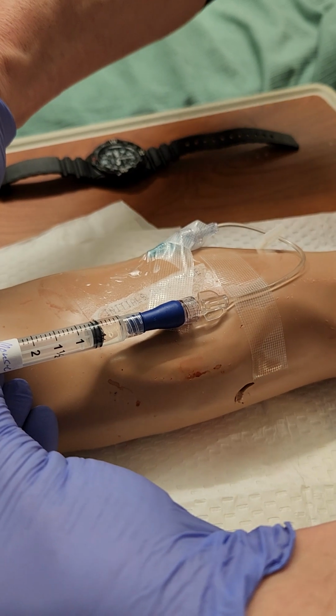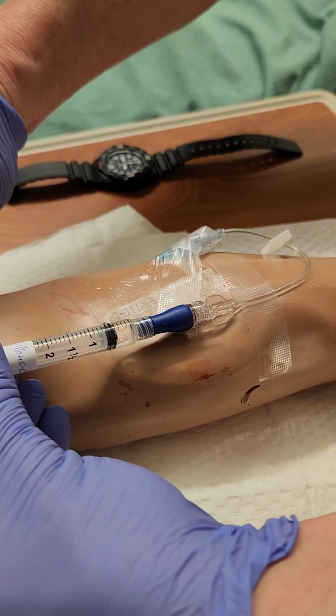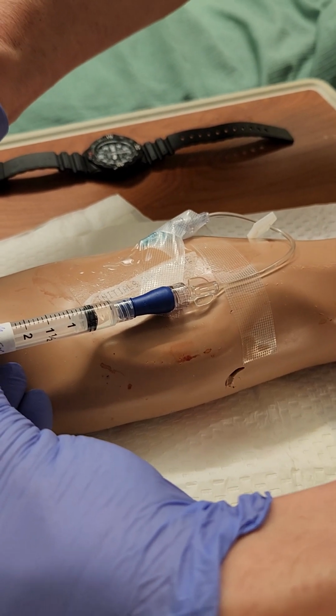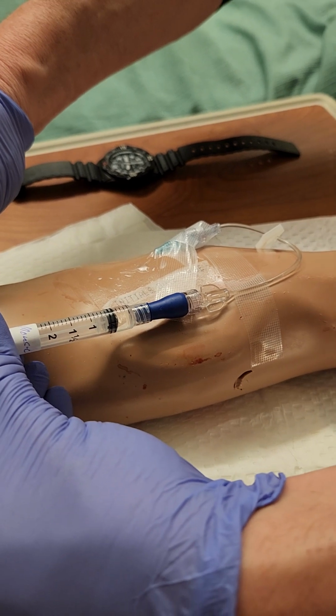We're right on track here. We're a little more than 3 minutes in. We've got a half a minute left. We're rocking this.